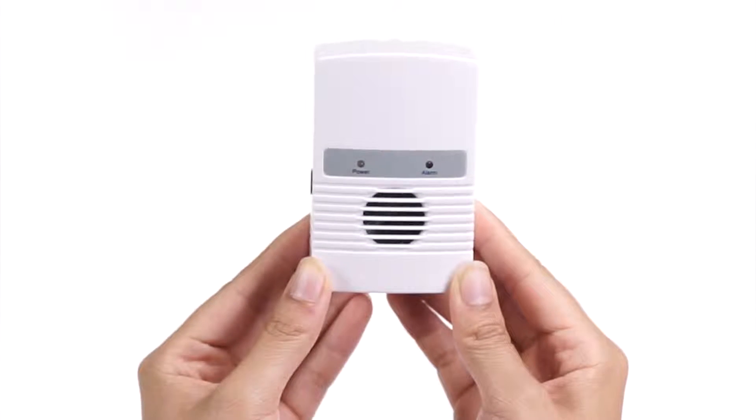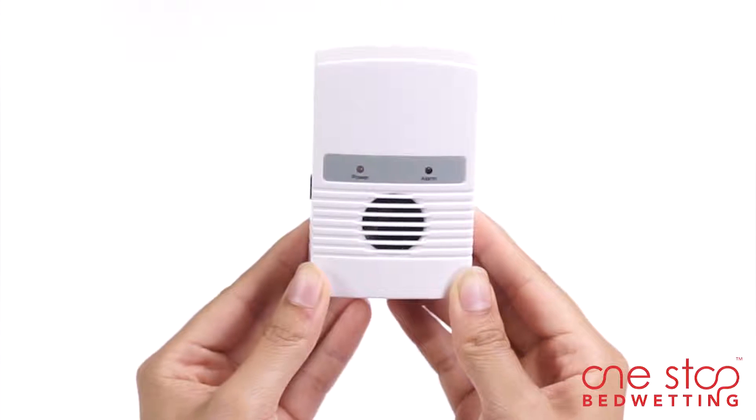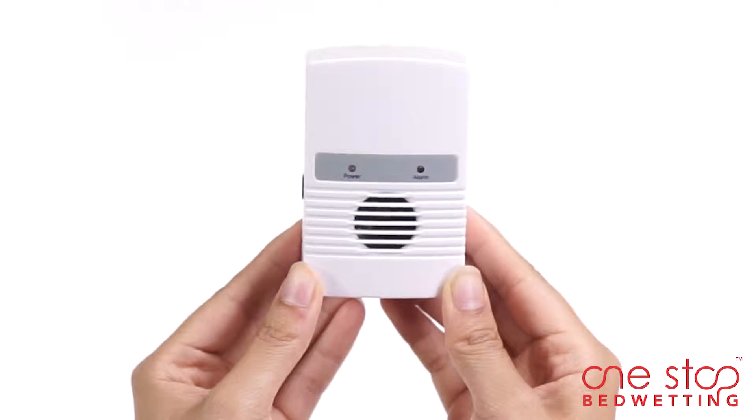Boost is a comfortable bedside bed wetting alarm designed exclusively for teens and adults. The alarm helps establish a connection between the brain and the bladder signals and eventually conditions the user to wake up before wetting the bed.